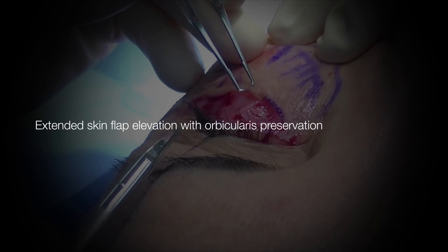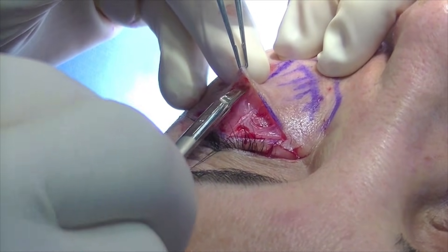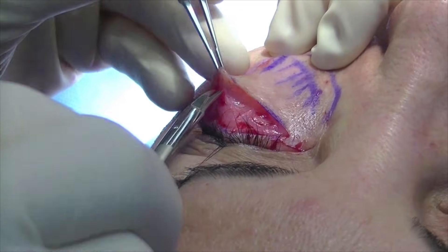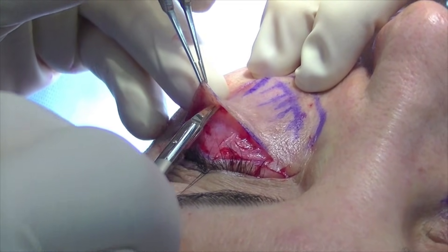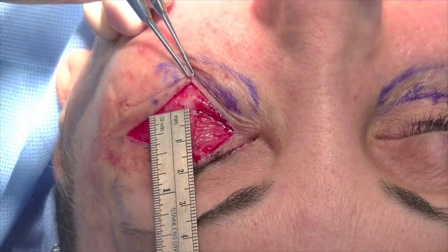In order to preserve orbicularis function, a skin flap is elevated in an extended fashion inferiorly using sharp scissors. This dissection is continued down for approximately 1.5 centimeters from the lash line, as demonstrated here with the ruler.